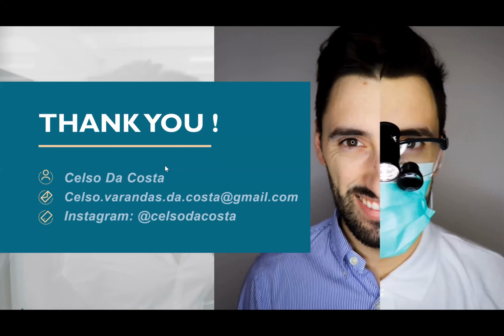Can this procedure be used on orthodontic patients? To get the best results, do the Click after the orthodontist. You can do the GBT on orthodontic patients, in Invisalign, brackets, you name it. But for the whitening, of course, you need to remove all the attachments for the Invisalign and all the brackets, to get the most tooth surface in contact with the product. So after the orthodontic treatment I have a lot of these: the orthodontist finishes the treatment, sends me the patient for prophylaxis, and then we do the whitening too. During the treatment, I say no. After, of course, you can do it.